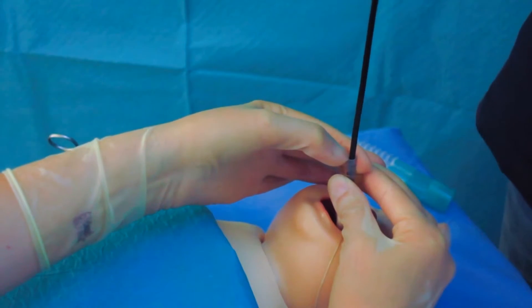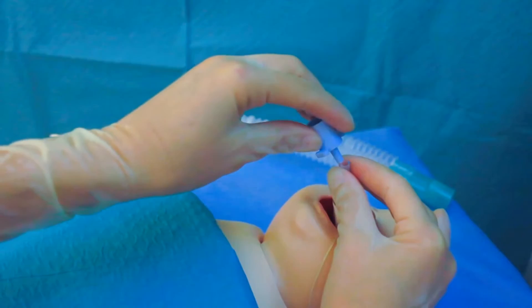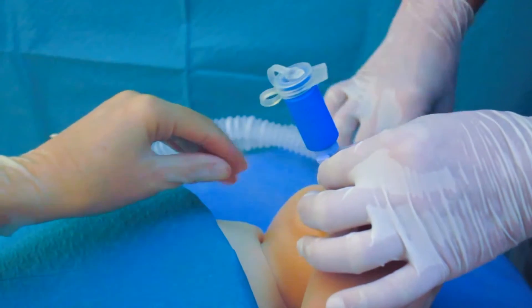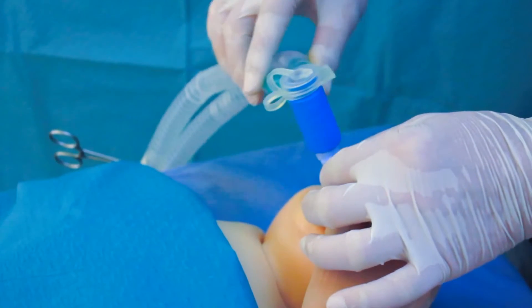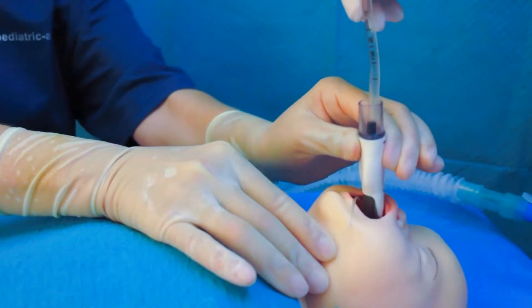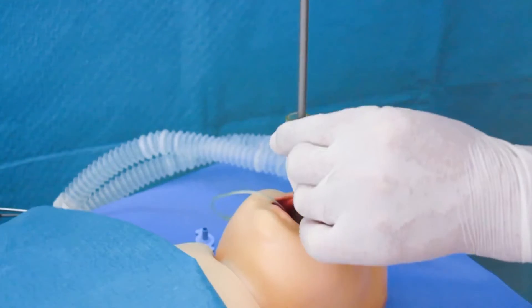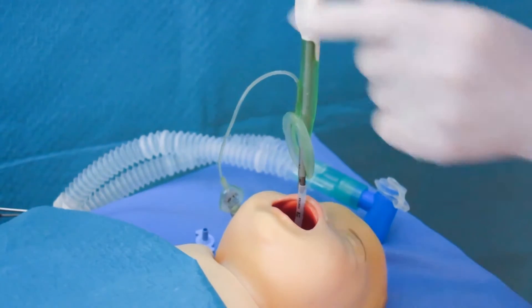Why do it? After successful fiber optic intubation via the laryngeal mask, you will in most cases remove the laryngeal mask to allow access for surgery. We demonstrate two techniques how you can pull out the laryngeal mask leaving the endotracheal tube in place.